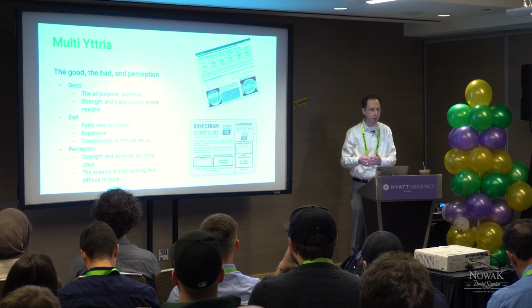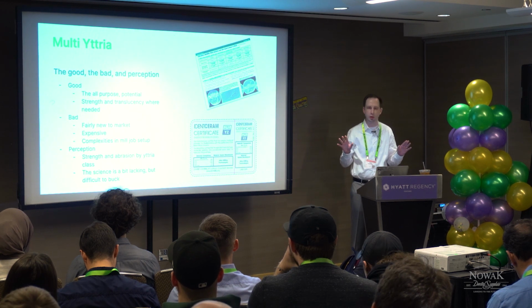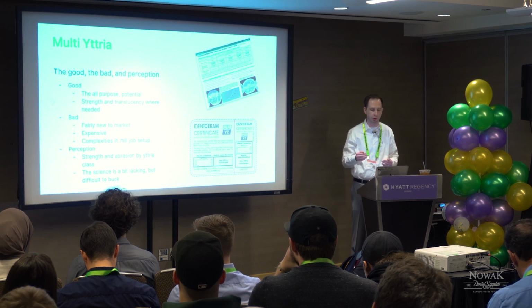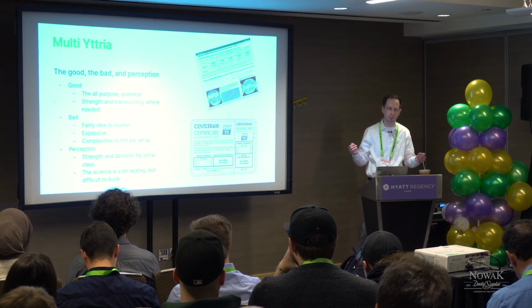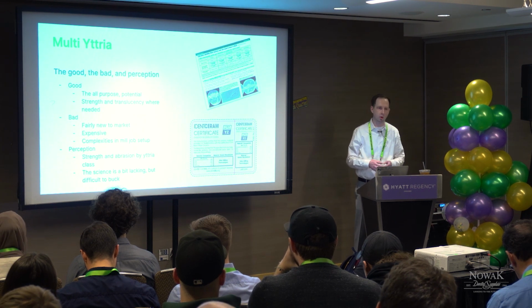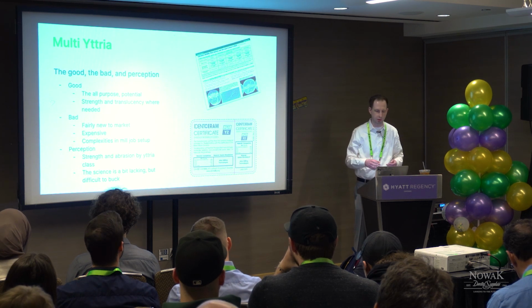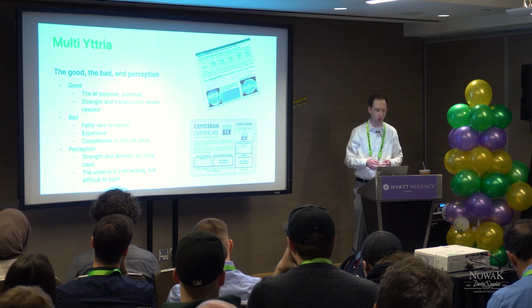But the bad is it's fairly new to the market, and we're all a little bit gun shy on new things to market. You sort of want to see where it's landing, what becomes like the best in the market. And a lot of them are very, very expensive. So when you're thinking about your zirconia portfolio, cost has a big impact here, right? You don't want to have your economy crown milled in a $200 disc because you're going to be losing all that money on boosting material costs.